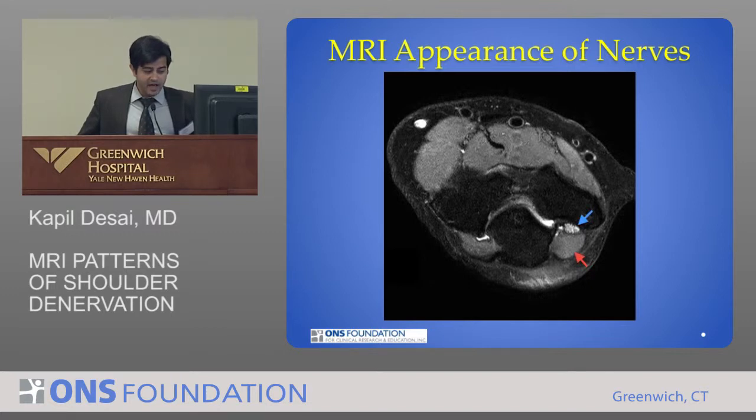Now, here's a very, very abnormal ulnar nerve. Also an elbow. This patient has this bright, thickened ulnar nerve, which is being compressed by this muscle, which is an anconeus epitrochlearis, an accessory muscle pushing on this nerve. In this case, it's kind of a no-brainer.